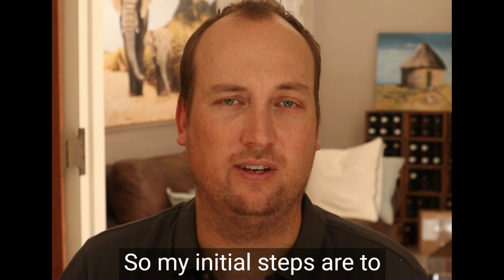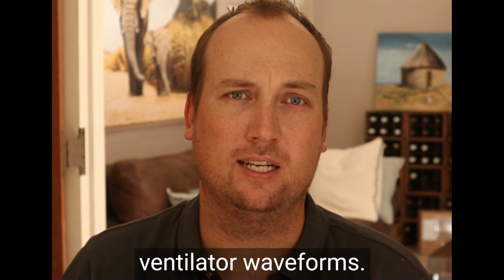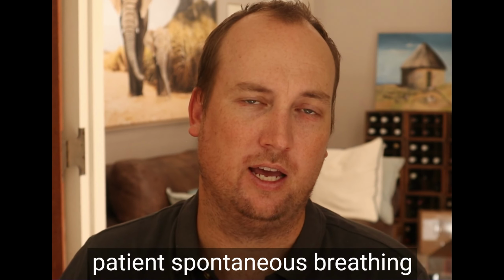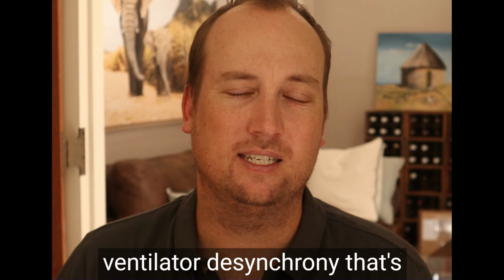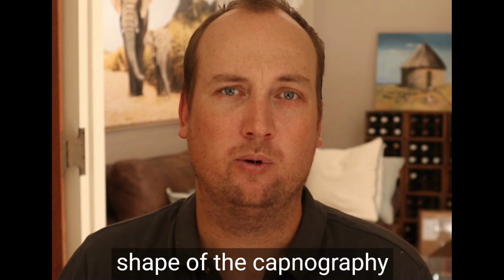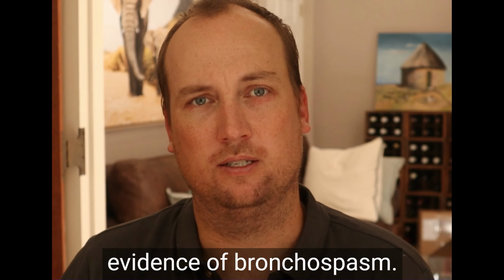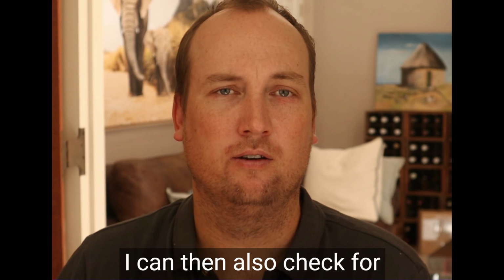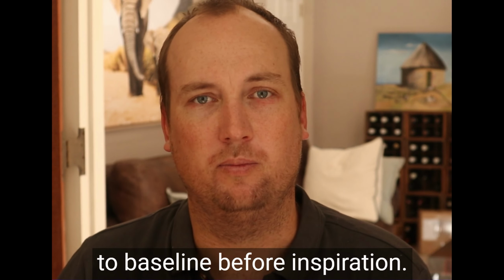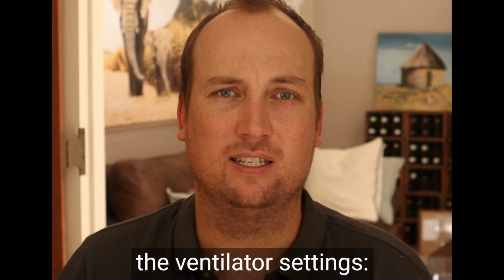So my initial steps are to ventilate on 90% oxygen. I quickly then review the ventilator waveforms. I want to look for evidence of patient spontaneous breathing efforts because it might be ventilator dyssynchrony that's caused the high airway pressures. I want to look at the shape of the capnography waveform to see if there's evidence of bronchospasm. I can then also check for features of auto-PEEP, which is an expiratory flow that doesn't return to baseline before inspiration. I then also quickly review the ventilator settings.